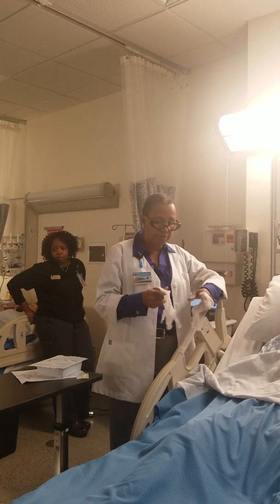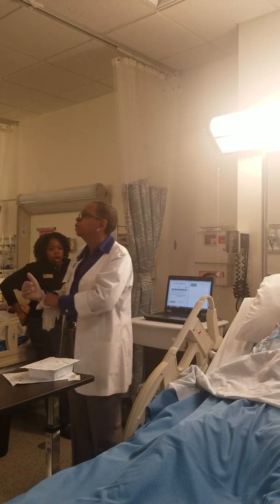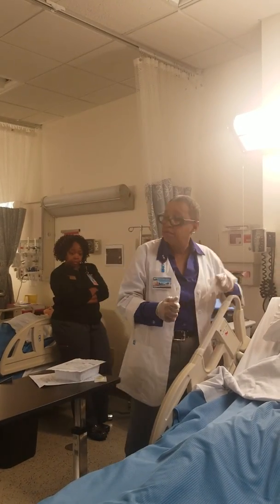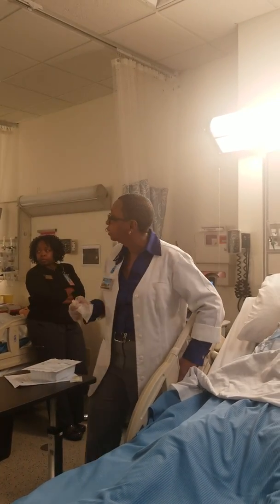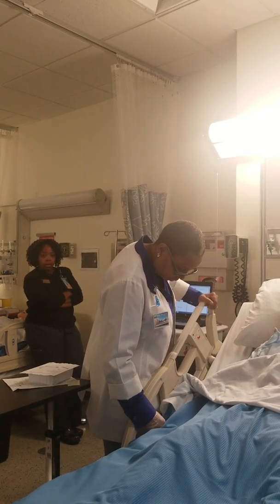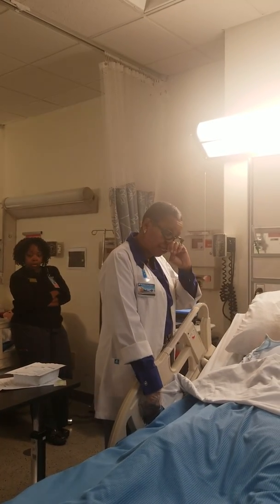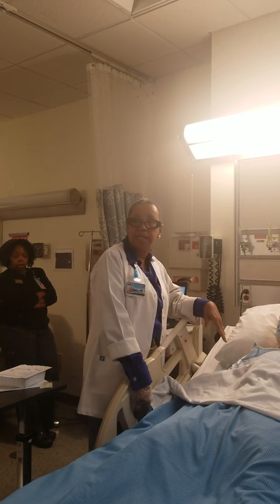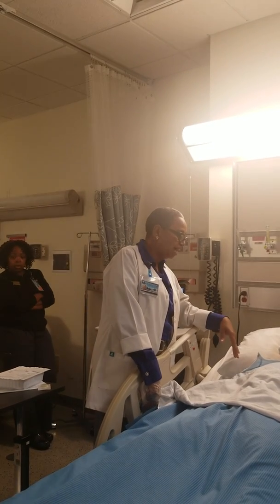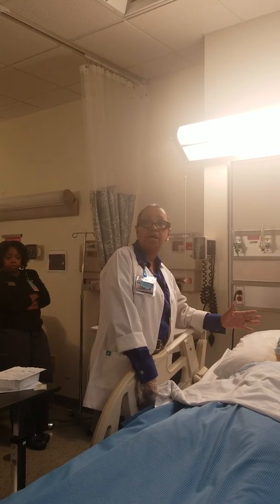So we want to explain the procedure, let him know what we're going to do. What about his position? You want to lay him as flat as possible. You may not be able to go flat, but you would like to lay him as flat as possible. Why do you want to do that? Because of the air bubble? That's right, air embolus. Go ahead and kill your patient with an air embolus. So you want to lay him as flat as he can tolerate it. He may not be able to go with his head all the way down, but as flat as possible. If he looks like that's about all he can do, that's all he can do.